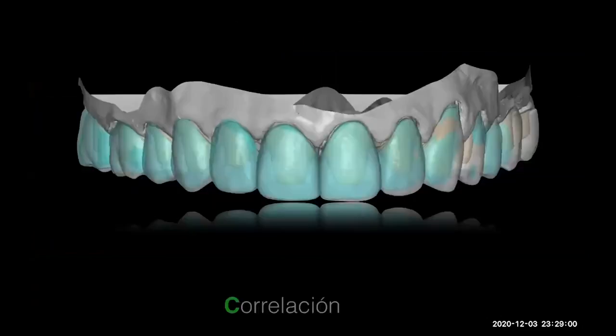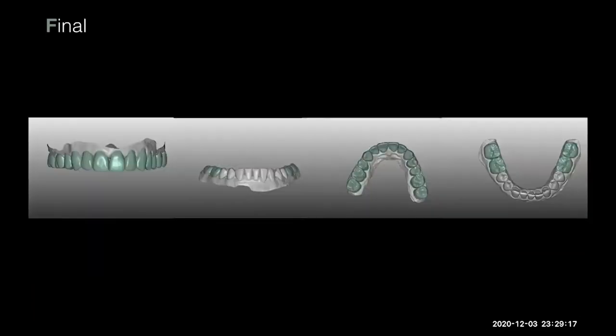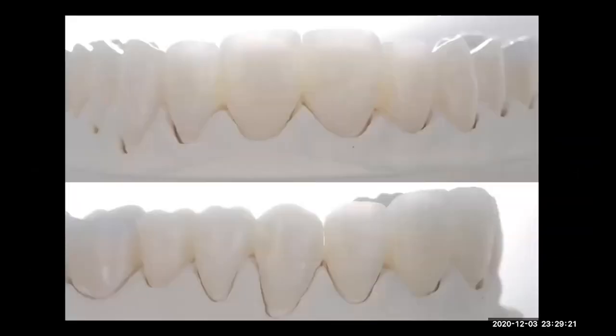You see, everything works from the same design. Now it's time to jump from PMMA to ceramic. So we talked with the patient, and the patient did some small changes. So we did the small changes, and in that case, we mill the wax, then we press.